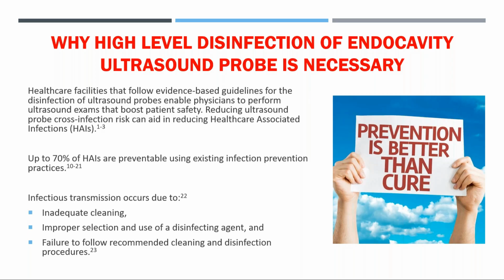Healthcare facilities that follow evidence-based guidelines for disinfection of ultrasound probes can allow the key issue. We all want to protect our patients, and that's what high-level disinfection allows. We decrease contamination, and we decrease healthcare-associated infections.